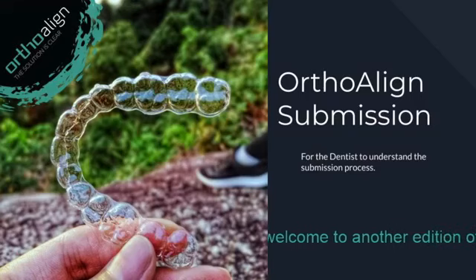Then the next thing we also need is these intraoral pictures. Intraoral pictures are very important because they help our orthodontist to see a better picture. Sometimes we have cases sent by intraoral scan, and the bite has already been taken by the practitioner, and they send it over to us. Our orthodontist will also double check the pictures with your scans. So we will have a QC check to double check the bite is correct. If your intraoral scan differs from the pictures you've sent us, we will definitely contact you to see whether or not the bite is correct.